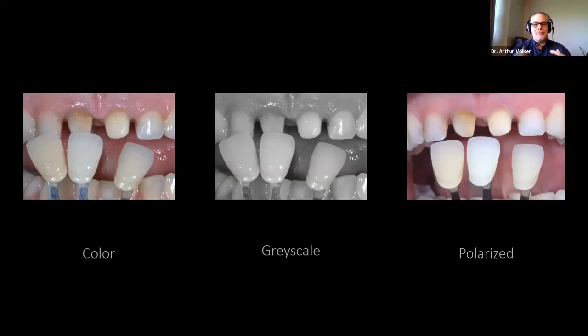The dentist says, okay, I'm going to take my shade photo, and they send the shade photo and they send everything to the laboratory. And then you get it back and you look and you say, that's great. What shade is it? And it always gets cropped or cut off. So it's very important to put that. It's a small point, but I was shocked by how many people actually inadvertently cut it off when they emailed it.